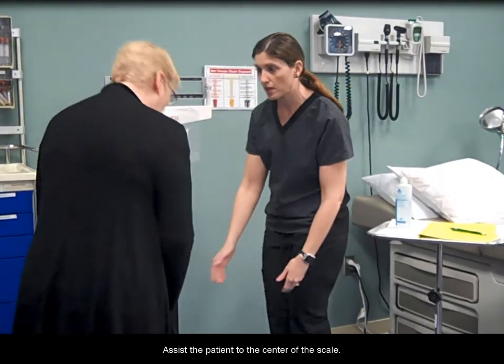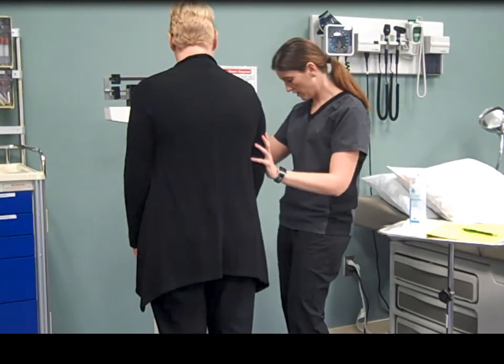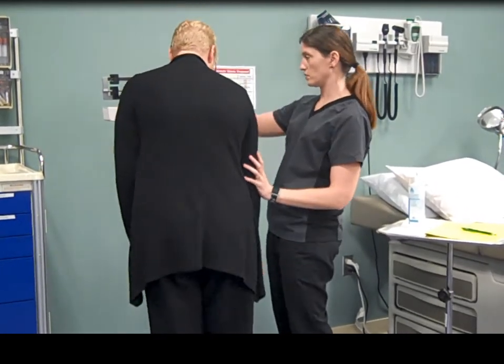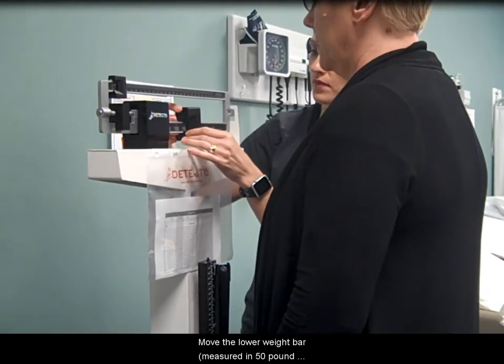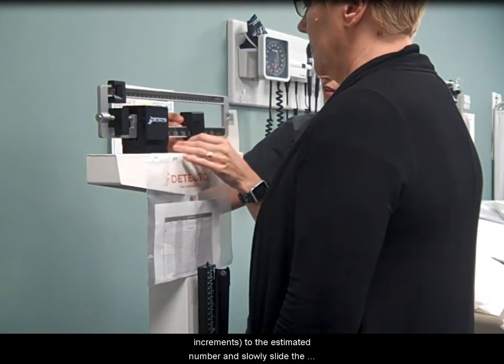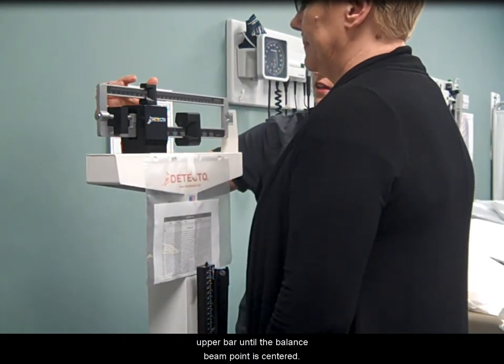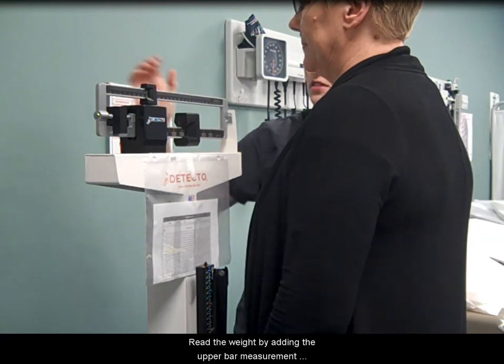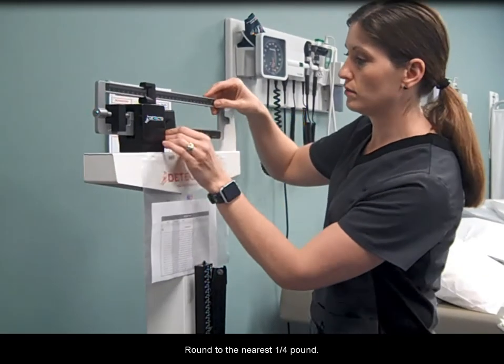Assist the patient to the center of the scale. Move the lower weight bar, measured in 50 pound increments, to the estimated number and slowly slide the upper bar until the balance beam point is centered. Read the weight by adding the upper bar measurement to the lower bar measurement, round to the nearest quarter pound.